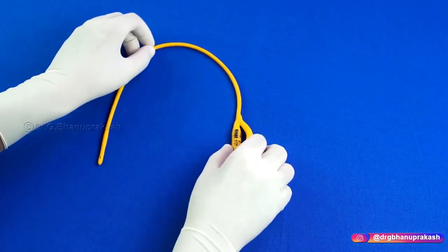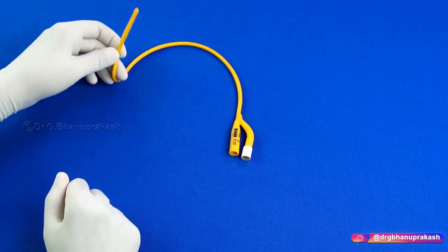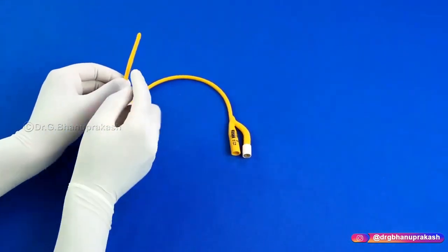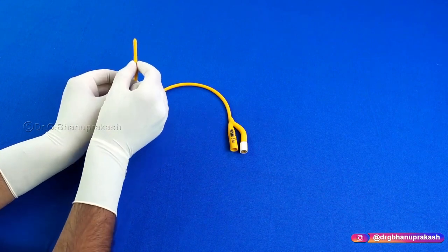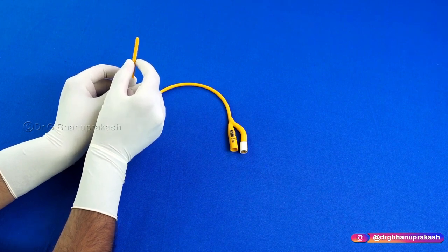After having covered the parts of the Foley's catheter, the second important thing you need to know is this: it is not visible here, but as you can see a small bulb-like swelling over here, which will be visible later on. This bulb-like swelling is called the balloon. I'll show you what a balloon is.